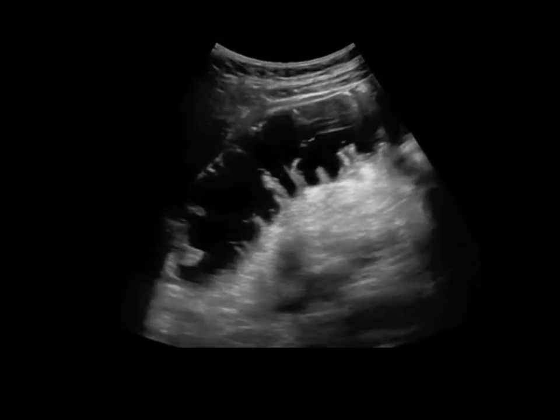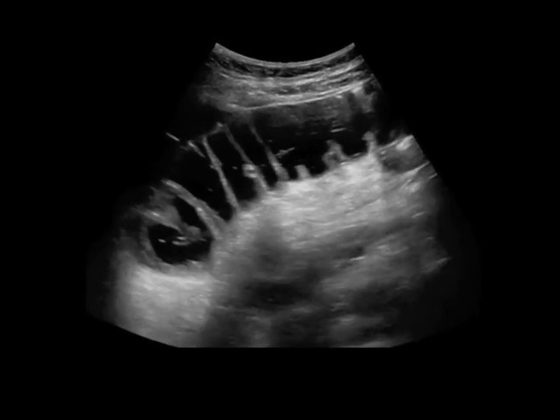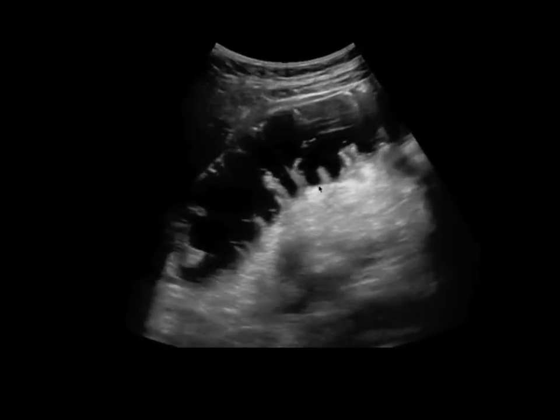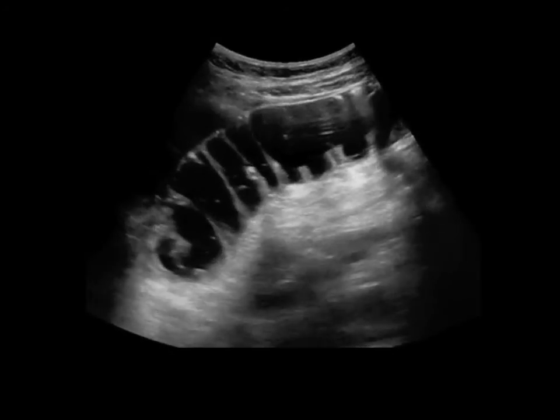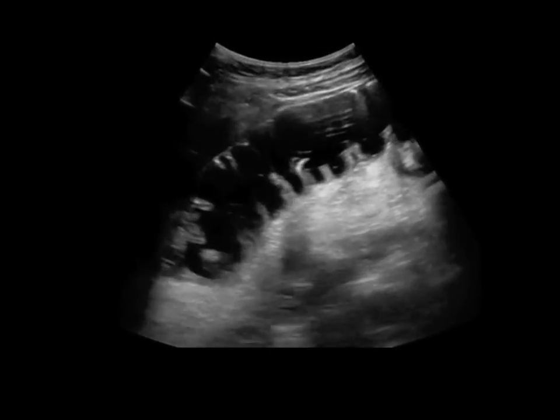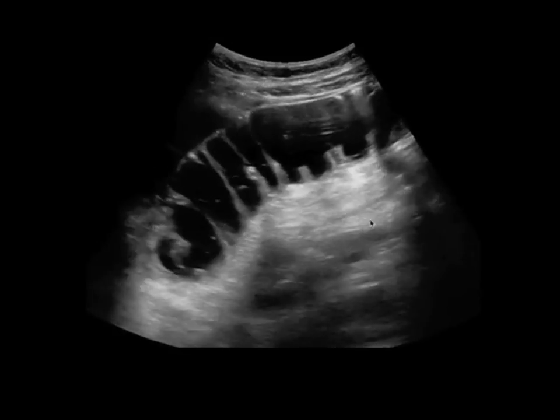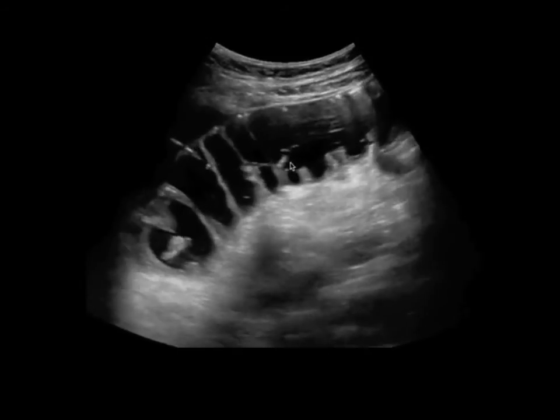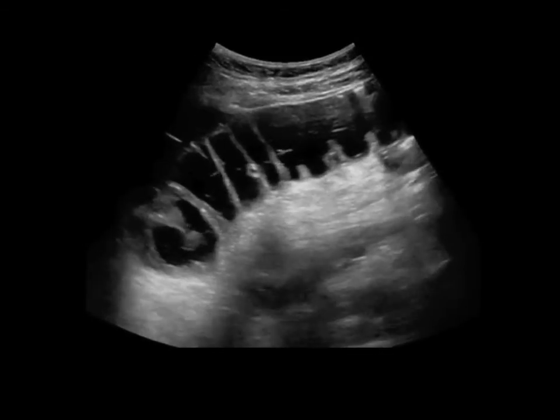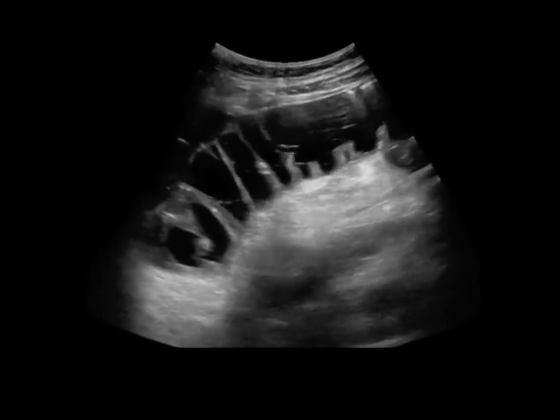Here's a nice example of a small bowel obstruction, and again you would measure from top to bottom of the bowel. You can see some of the plica circularis here. And then you'll see this back and forth peristalsis where it looks like the fecal matter is moving in one direction, but then it seems to drift backwards again. And this is what back and forth or pendulous peristalsis looks like.